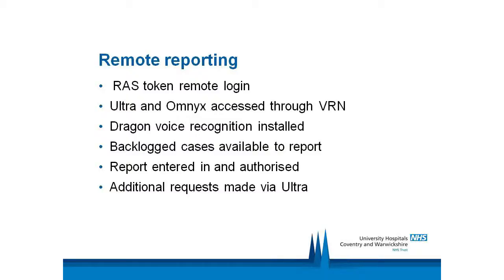The remote working is established by a RAS token secure login that enables you to access the secure network of the trust for many sites.